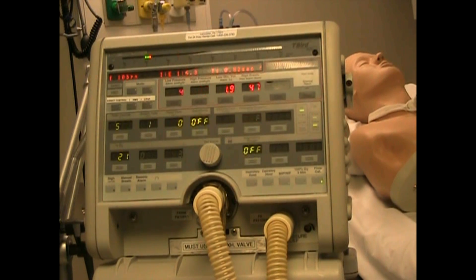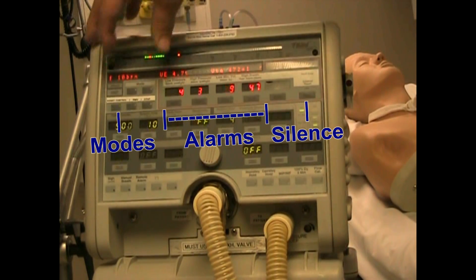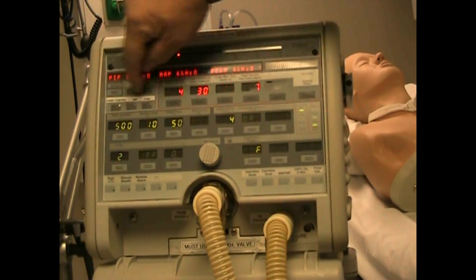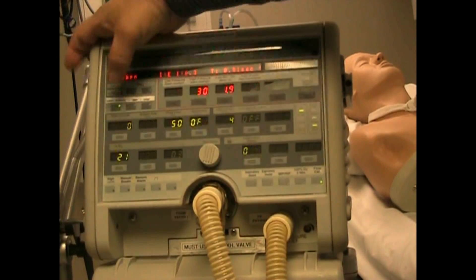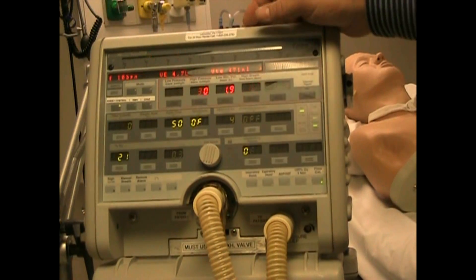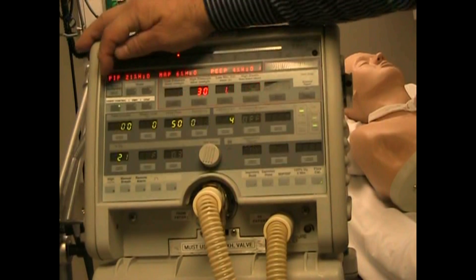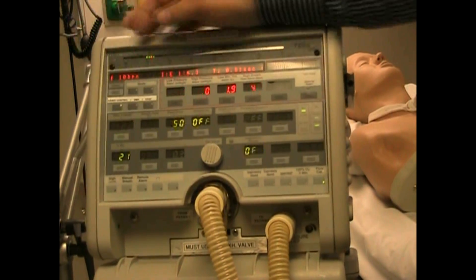The first section we have is the mode section and we have two blank mode controls. Then on the bottom you have assist control, SIMV, and CPAP. Just outside of that section is the monitor select button.